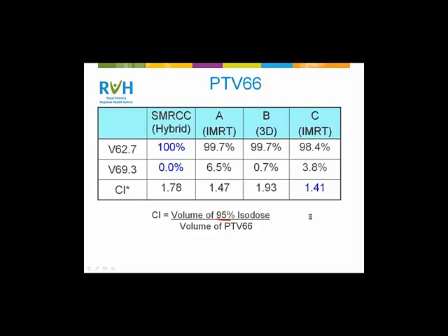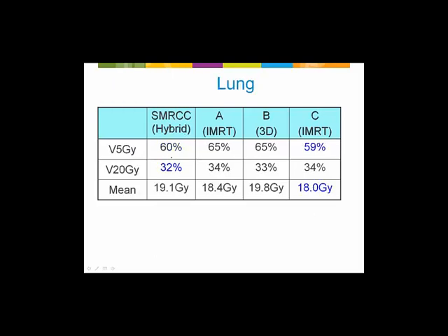HybrArc, another observation, the planning time was the lowest, and it's very consistent from plan to plan. The conformity of the HybrArc was better than 3D, but worse than IMRT. Okay, and the one I showed you was the worst that we've seen thus far.